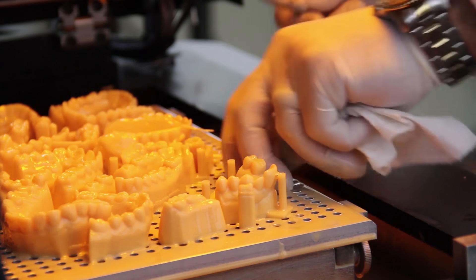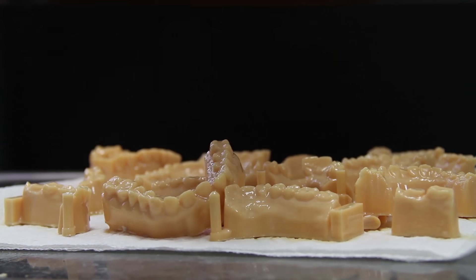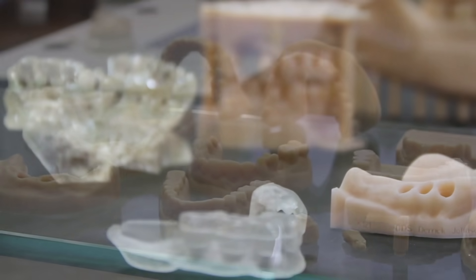These models have the lowest per-part post-processing time in the industry. That means in about 15 minutes, I can post-process an entire platform of models with virtually no hand-holding of the models throughout the entire process.